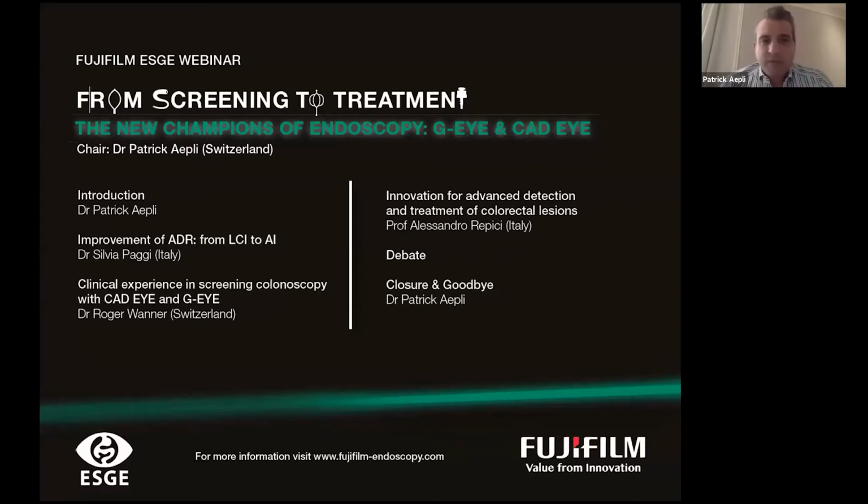It's well known that one of the most important quality indicators for screening colonoscopy is the adenoma detection rate, the so-called ADR, because of the extensive evidence that it correlates directly with colorectal cancer. Several studies showed that polypectomy prevents cancer and reduces colorectal cancer mortality up to 50%. However, we also know from the literature that colonoscopy is perhaps not that protective as we originally thought, particularly for right-sided lesions. We also must be aware that not all colonoscopists are equal. There is a significant 3 to 6-fold variation in the detection rate and the miss rate between different endoscopists.